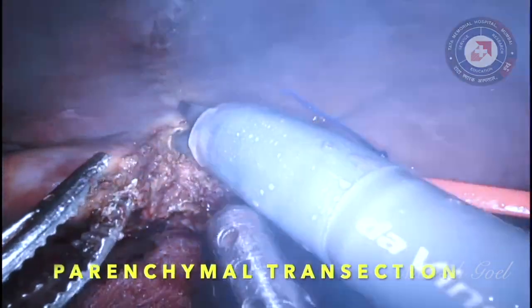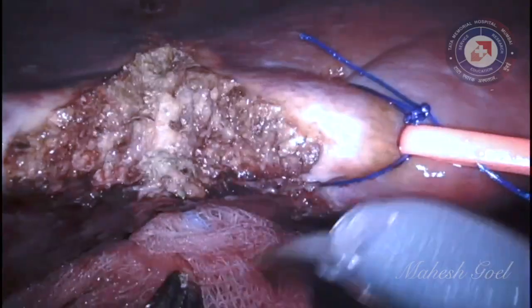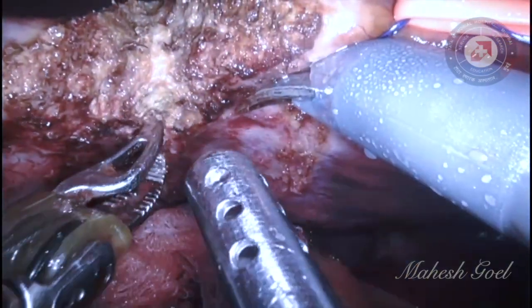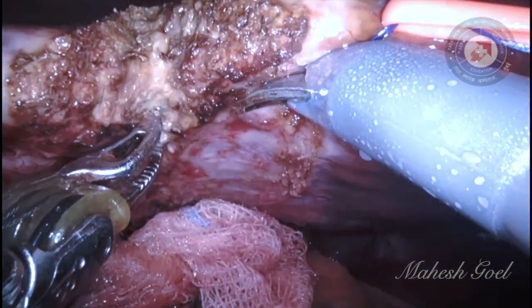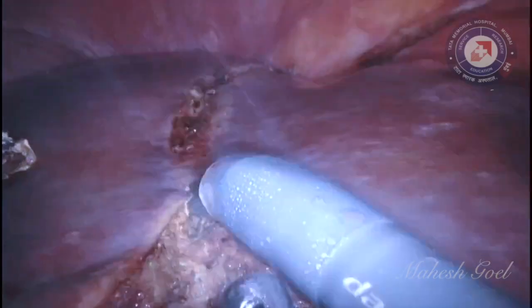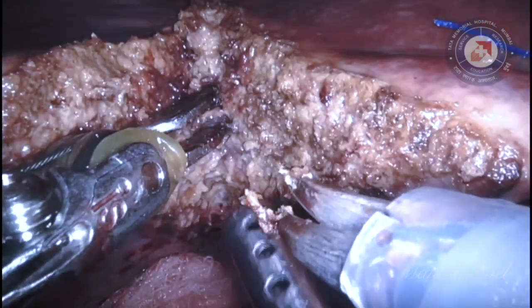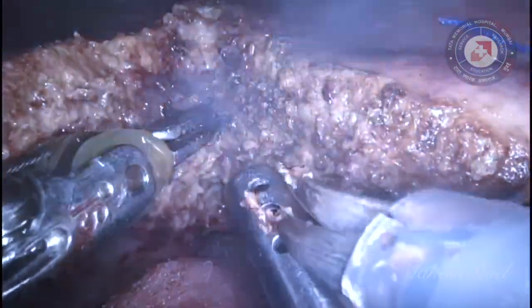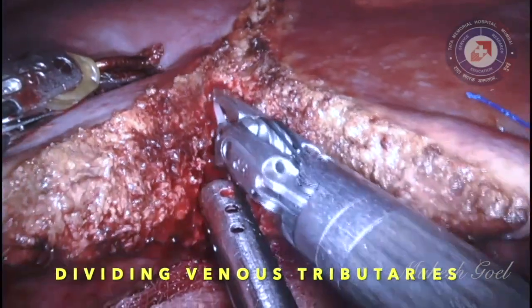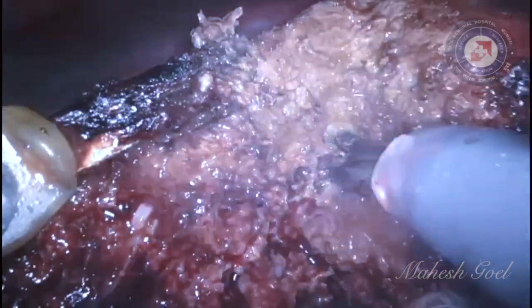With convenient traction on either side of the plane, we proceed with transection of the parenchyma along the line of demarcation seen previously. Parenchymal division is undertaken with a combination of bipolar cautery and clips to ensure safe and hemostatic ligation of vessels encountered along the way.